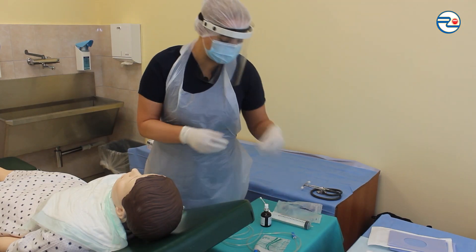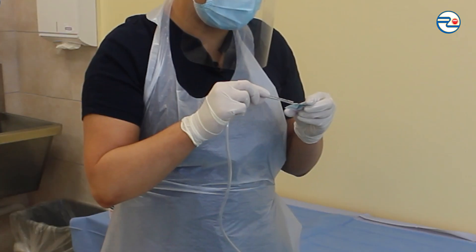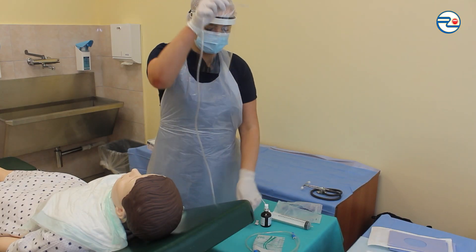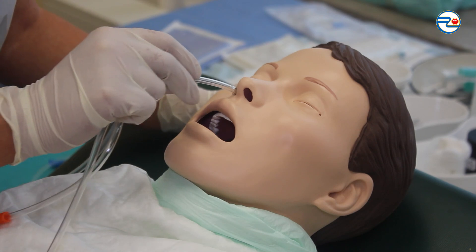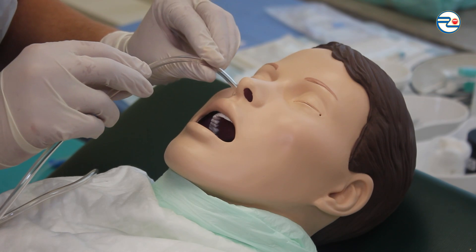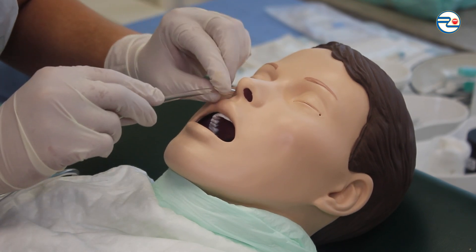Covering the tip of the nasogastric tube with lube and setting the tube into the right nose cavity about 10–15 cm. Instructing patient to swallow saliva, and with every swallowing motion, pulling the tube deeper.